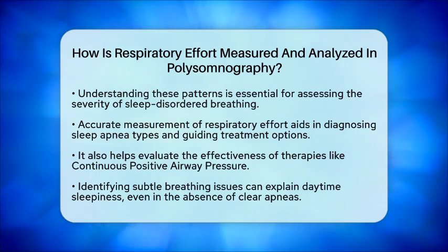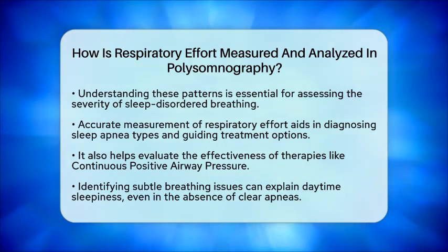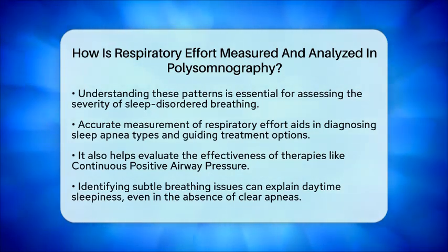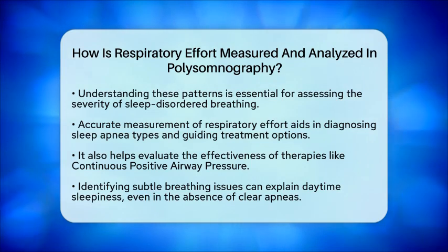Accurate measurement of respiratory effort is essential for diagnosing the type of sleep apnea and guiding treatment options. It also plays a role in evaluating the effectiveness of therapies like continuous positive airway pressure. This measurement can even help identify subtle breathing issues that might lead to daytime sleepiness, even if clear apneas are not present.